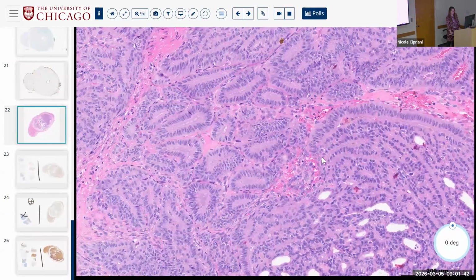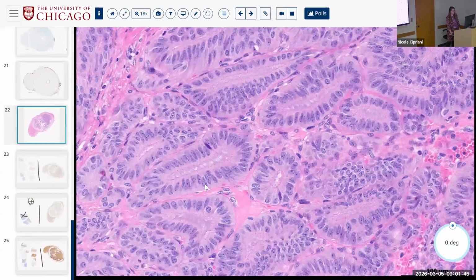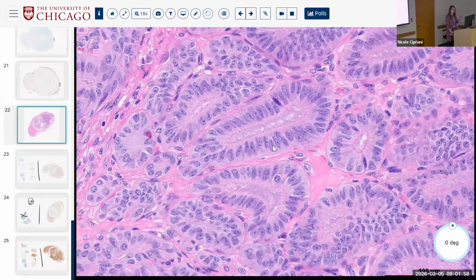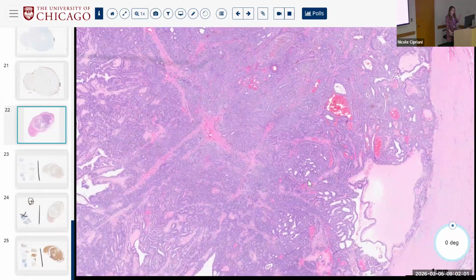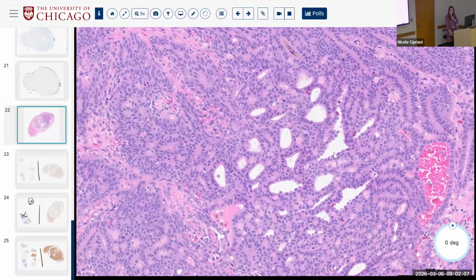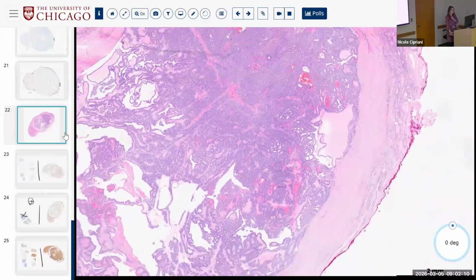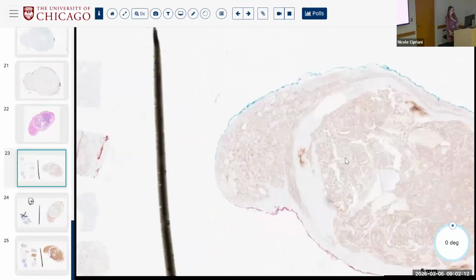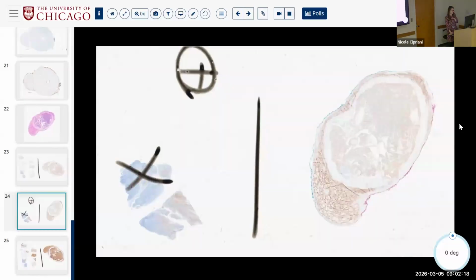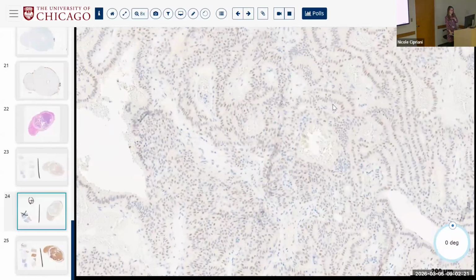This is a follicular and sort of papillary pattern neoplasm that has elongated dark nuclei, but again, not really PTC nuclei, not cleared, not wrinkled, but elongated and maybe grooved, but with very fine chromatin. It has these punched out holes, so maybe quote unquote cribriform. This is cribriform morular. So these are no longer considered a subtype of PTC. They are positive for TTF1. They are negative or very weak for PAX8.